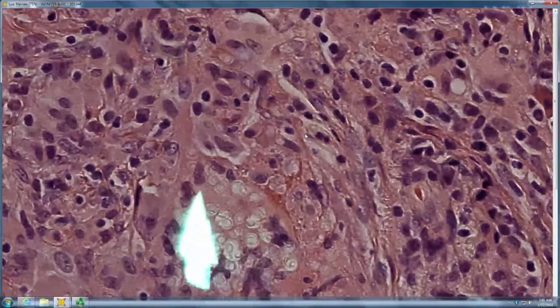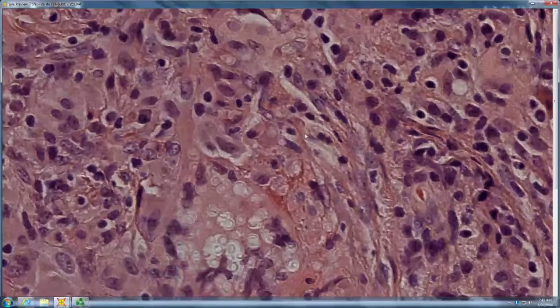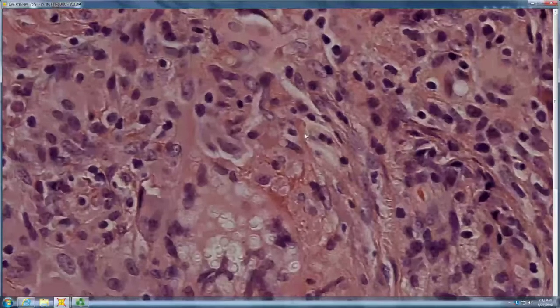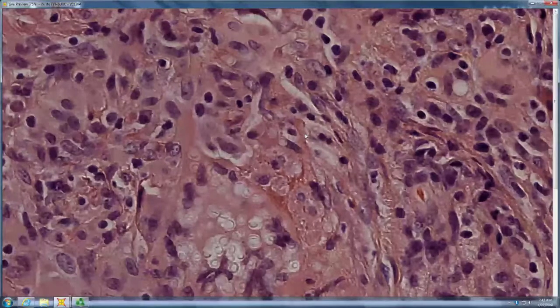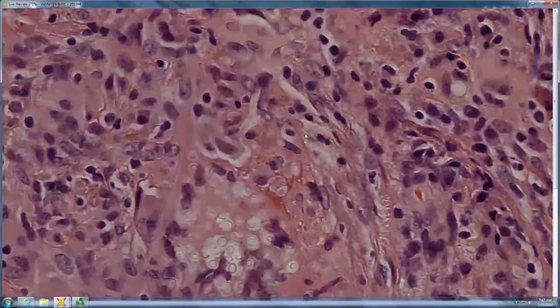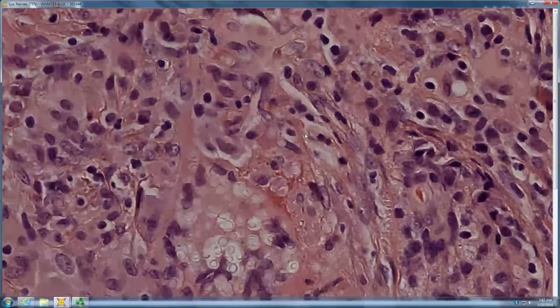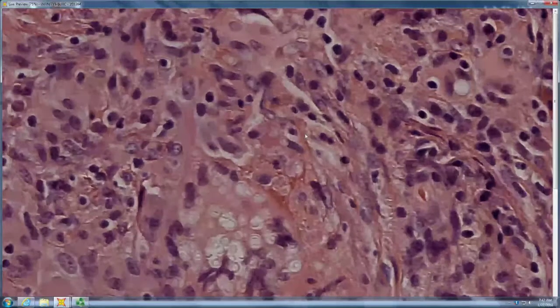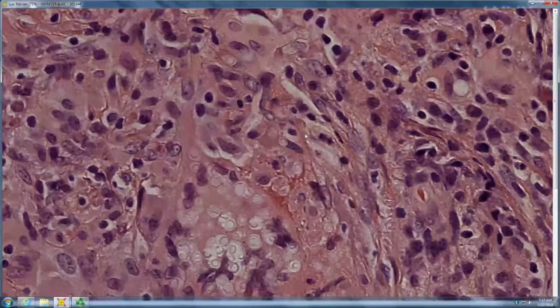And are they all the same, or are they pleomorphic, different sizes and shapes? Pleomorphic. Yeah, like crypto. Exactly. So that's Cryptococcus. You make out that it's not a thick refractile cell wall, it's a capsule, and it's a pleomorphic yeast. So pleomorphic hollow yeast, round to oval, vary in size and shape, capsule. The more granulomatous, the less capsule. So this doesn't have a whole lot of capsule to it because there's granuloma there, right? The more granulomatous reaction, the less capsule you get in crypto. But they're always going to be hollow pleomorphic yeast.